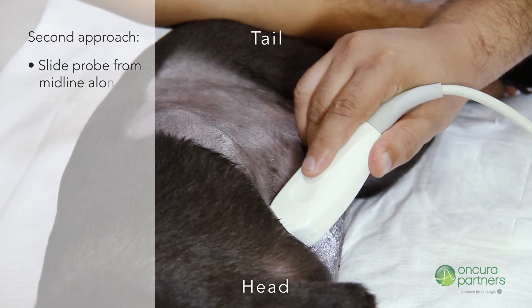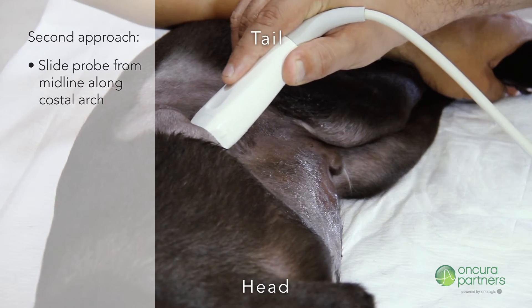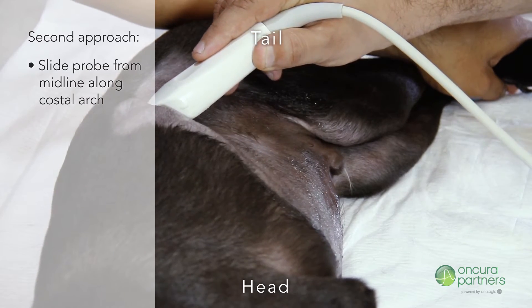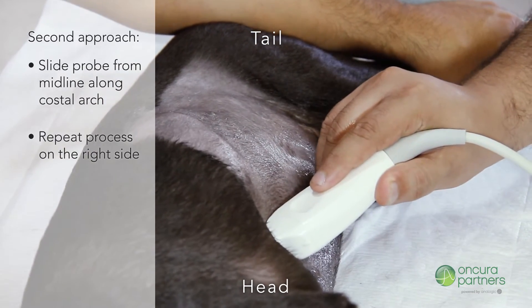For the second approach, slide the probe from midline along the costal arch towards the spine to obtain video and images of the left side of the liver. Repeat the process on the right side.